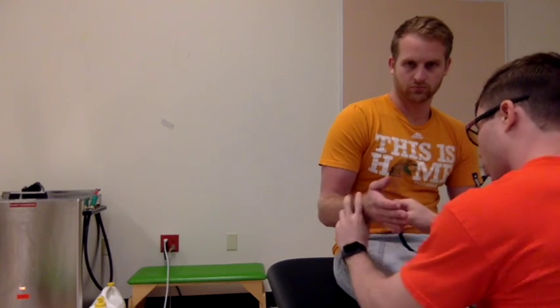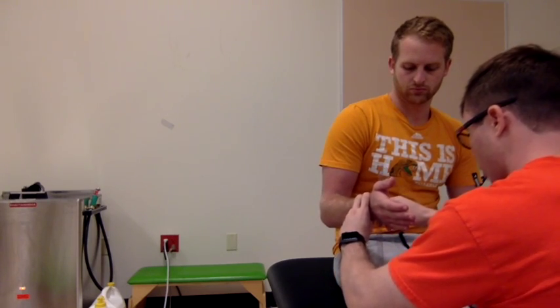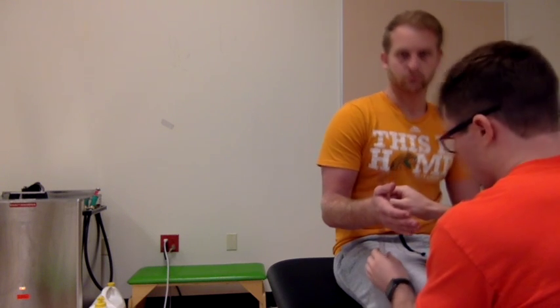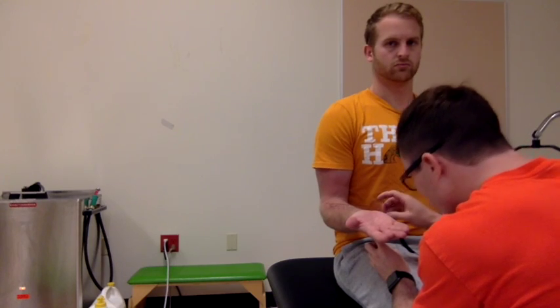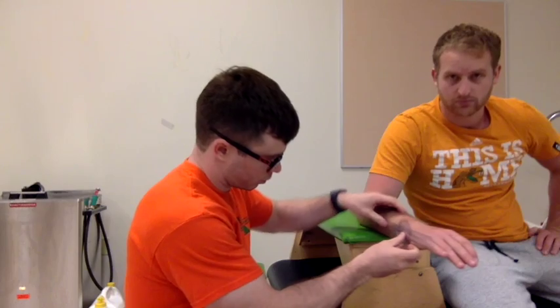The axis proximal to the ulnar styloid process. Go ahead and perform supination. Looking at approximately 95 degrees.